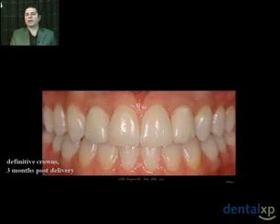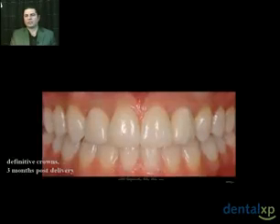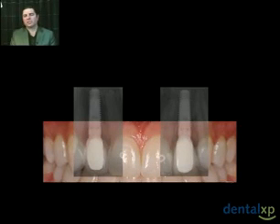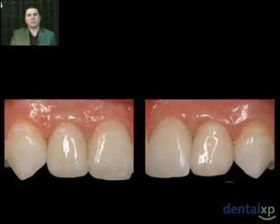These are the definitive crowns 3 months post-delivery in Jenna's mouth, 7 and 10 region. Let's have a look at the x-rays. And these x-rays are superimposed over Jenna's teeth to give you a better indication of vertical positioning of the implant, interproximal peaks of bone, providing us with a definitive cosmetic result.